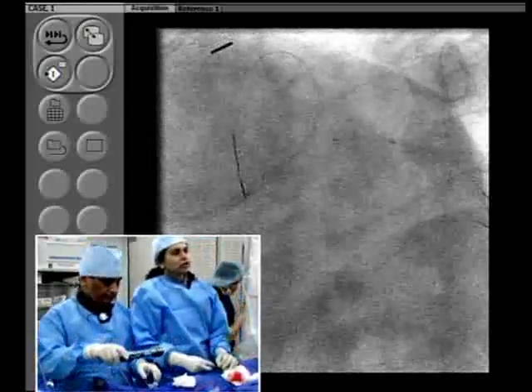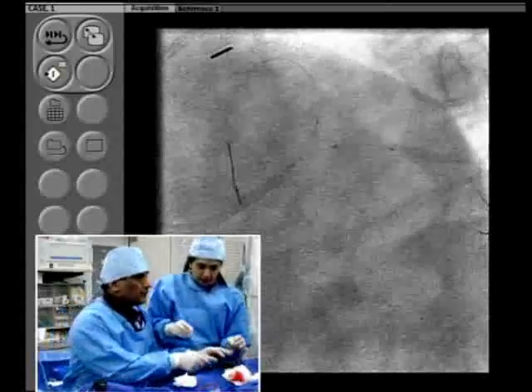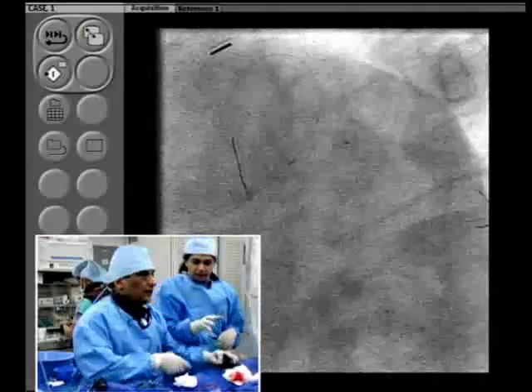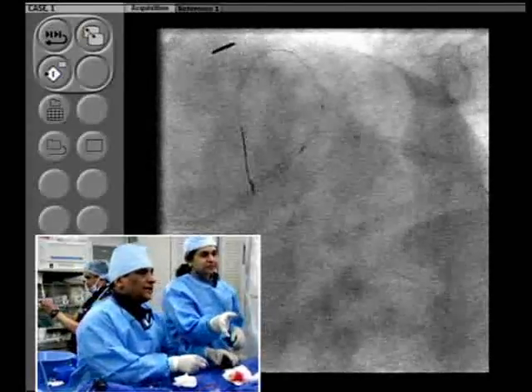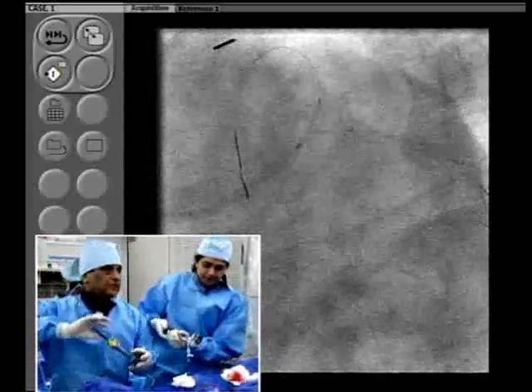Going back to your question of stent boost, we do have stent boost in both the new Philips labs. But again, the use is probably less than 1%. One of the reasons in this case would be different because of the clips. The surgical clips will really cause a lot of issues in terms of stent boost.